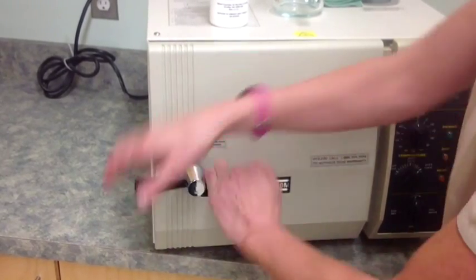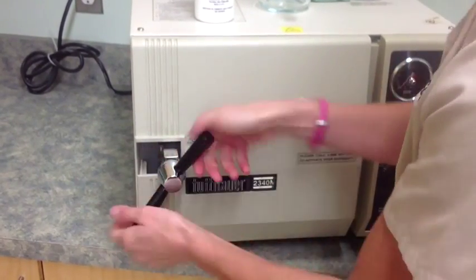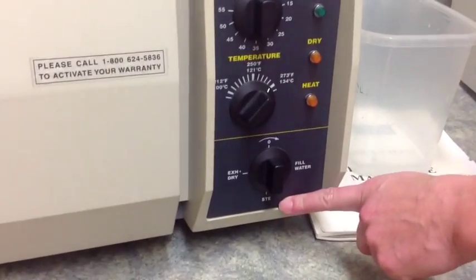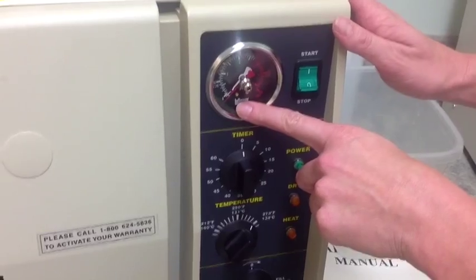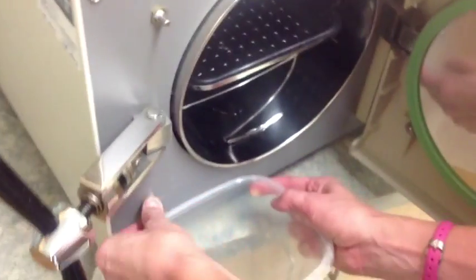After that cycle is complete, drain the autoclave and seal the door tightly. Turn the multipurpose valve to sterilize and turn the machine on.